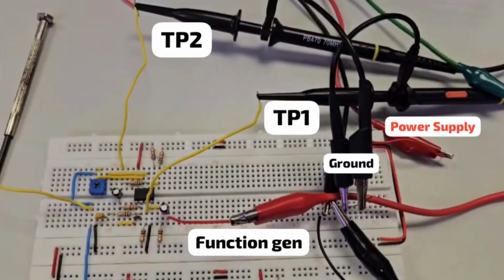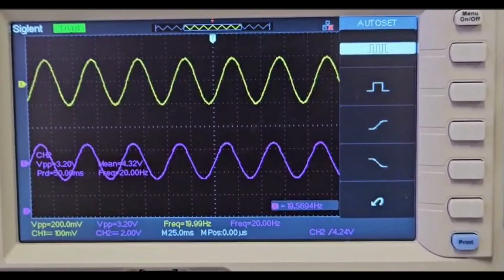So for stage 1, I put channel 1 to TP1 and channel 2 to TP2, and the function generator is connected there, and the power supply and ground. So we'll be setting our VPP as 200 millivolt, and that is our V in. And for our frequency here is 20 Hz, and for our V out it's 3.2 volts here.